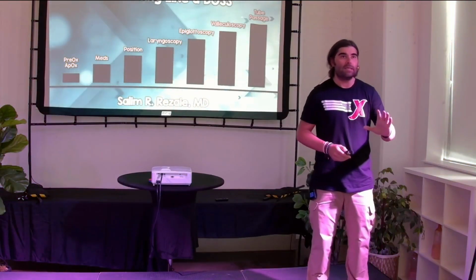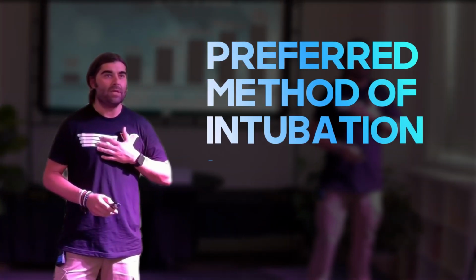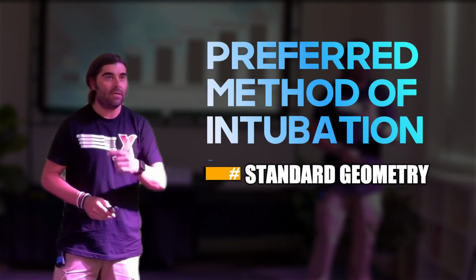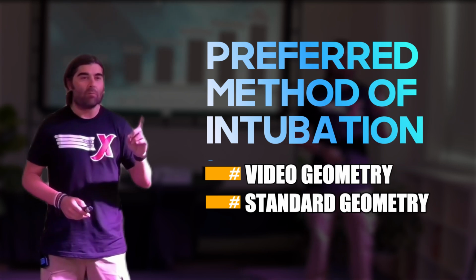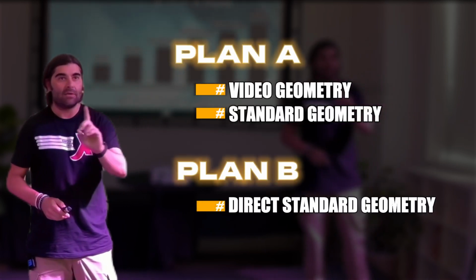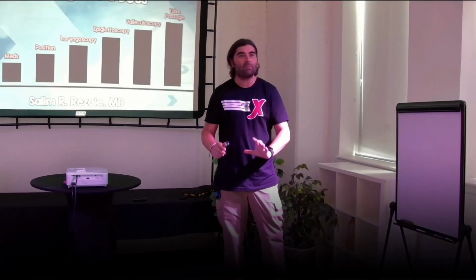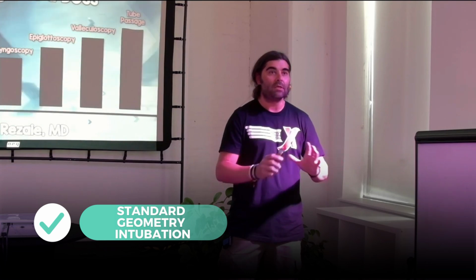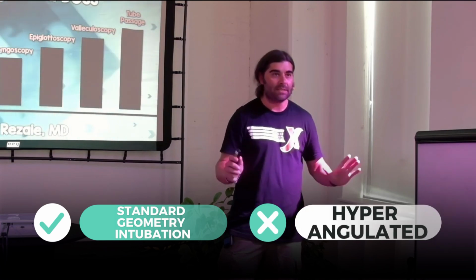The second thing is that my preferred method of intubation is standard geometry, not hyperangulated, and video is my number one. So video standard geometry is my plan A. Direct standard geometry is my plan B. So everything I'm going to talk about is in regards to standard geometry intubation, not hyperangulated. That is a separate talk.